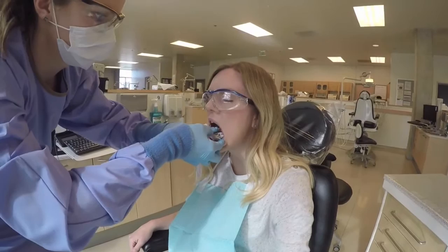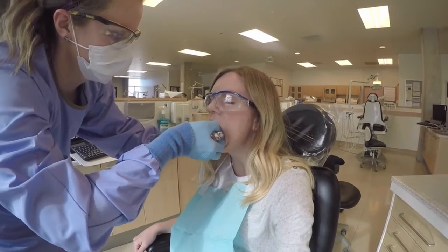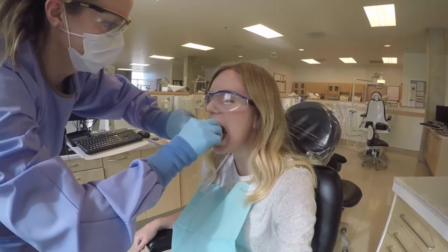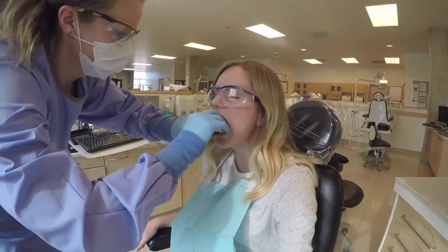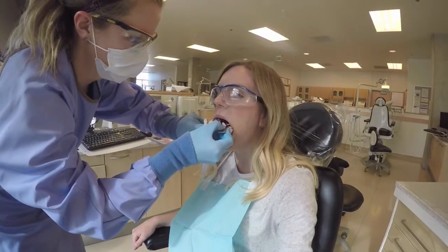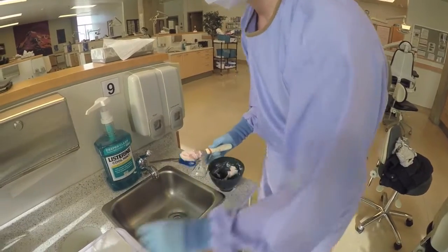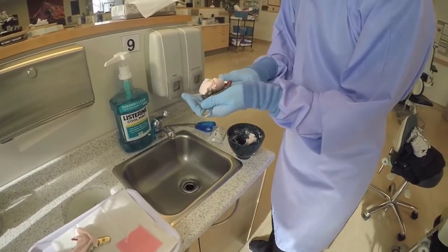Use one finger to hook under one side of the tray and pull away from the arch to release suction. You can then remove the tray from the patient's mouth by again turning the tray sideways as you pull the tray out. Now you can repeat the steps for mixing the alginate for the maxillary tray.